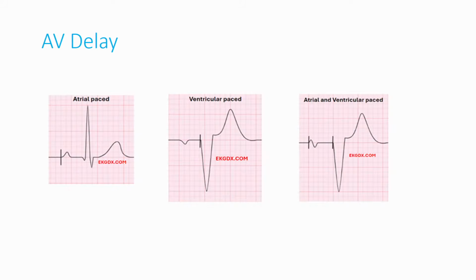There's no fixed thing for you and me. You may have a different one, I may have a different one. So for that patient, what is his PR? Keep it a little longer than that. If the patient's native conduction fails, the QRS is anyway there from the pacemaker. Right, Anand? Correct, yes, right? Exactly.